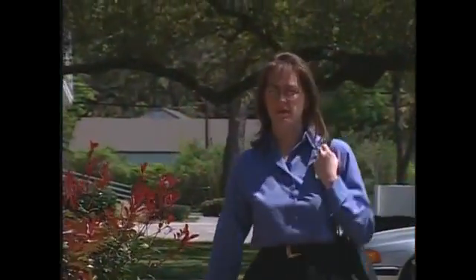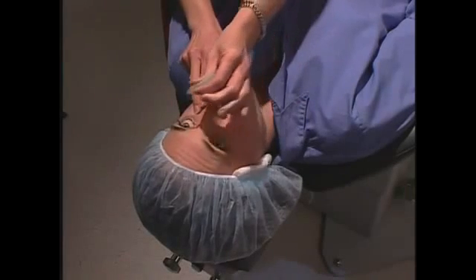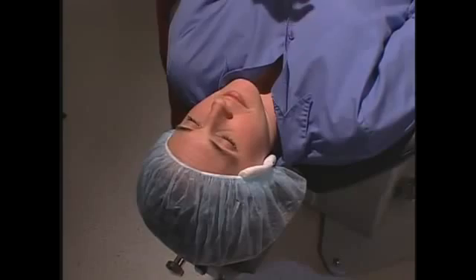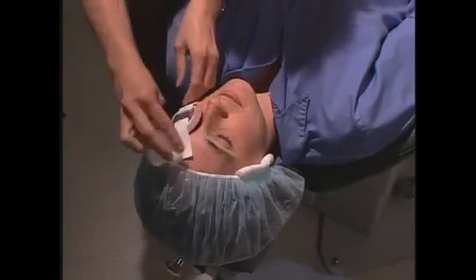Your procedure will be done during a brief outpatient visit. You'll need to arrive about an hour before your scheduled procedure. You'll be given eye drops and possibly a mild sedative. You will remain awake and should be quite comfortable during the procedure through the use of very effective anesthetic eye drops. Your eyelids will be held open to prevent you from blinking.